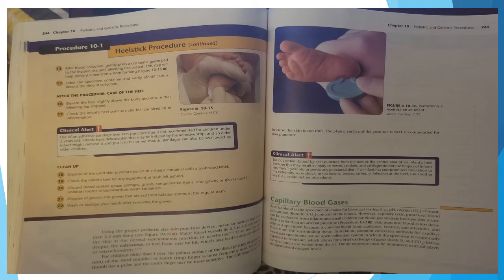However, capillary skin puncture blood can be collected from infants and small children for blood gas analysis because this procedure is safer than an arterial puncture. Skin puncture blood is less desirable as a specimen because it contains blood from capillaries, venules, arterioles, and fluids from surrounding tissue.